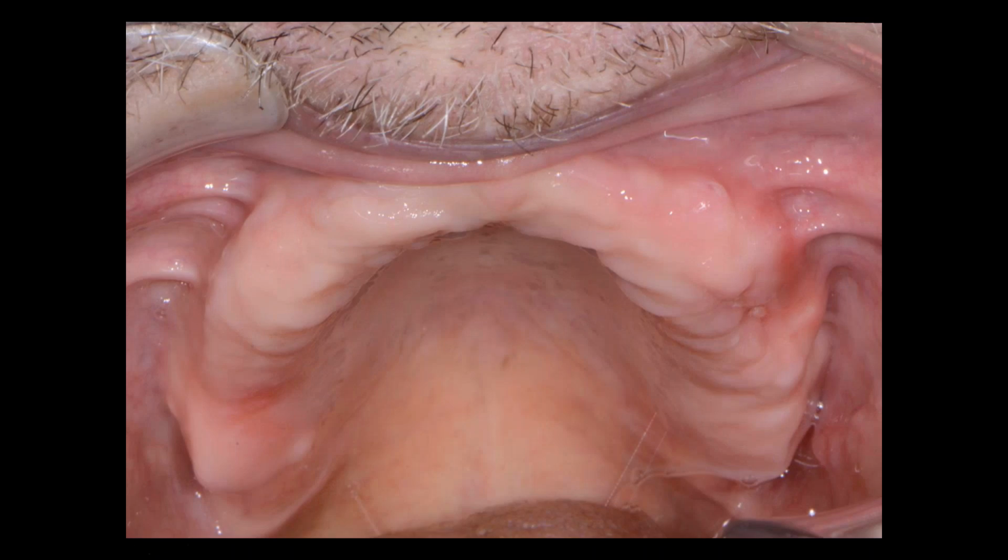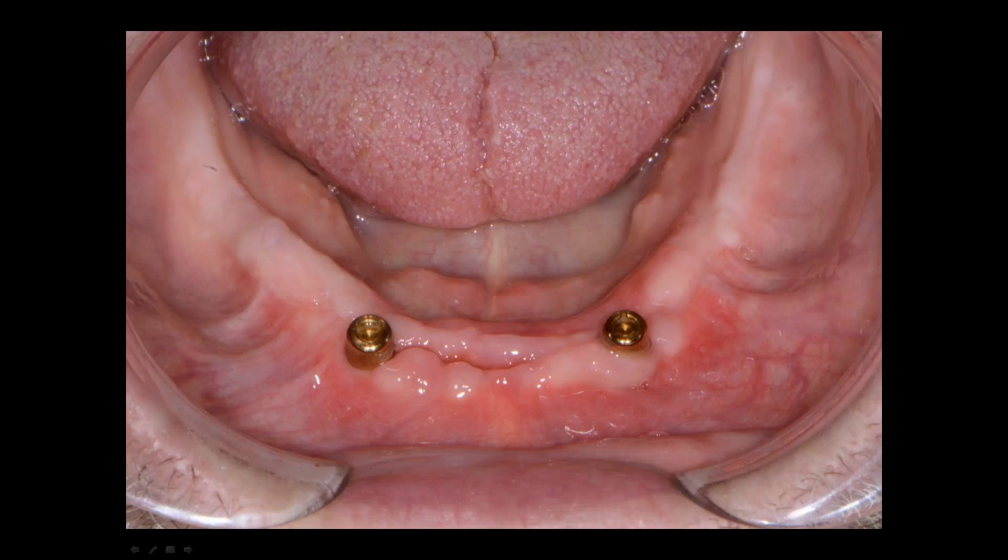Notice nicely the ridges heal. But more importantly, look at the bottom. In the lower arch, we see that there's still just a bit that needs to heal, but the dentin graft has integrated with the tissue surrounding this. This is only weeks later, and because I'm comfortable with the Engage immediate fixation, especially with the auger tip, I went ahead with direct pickup at the 2-week mark.